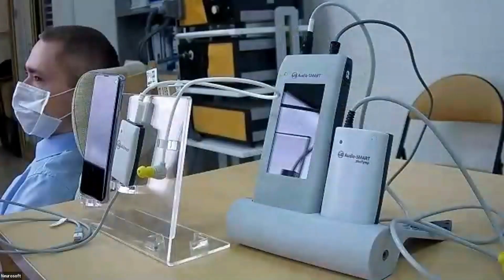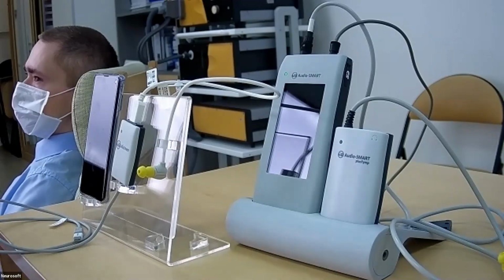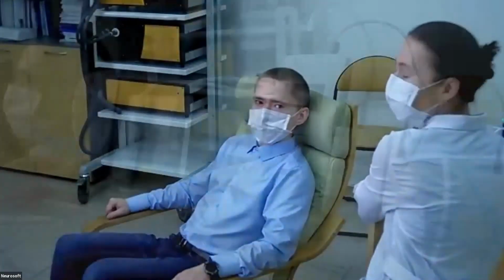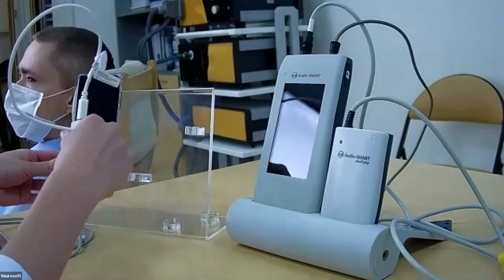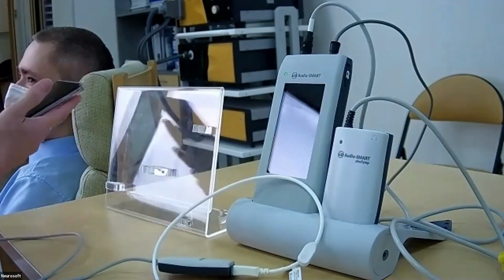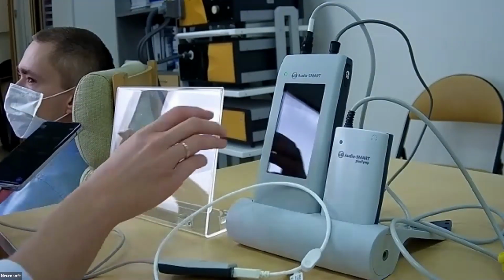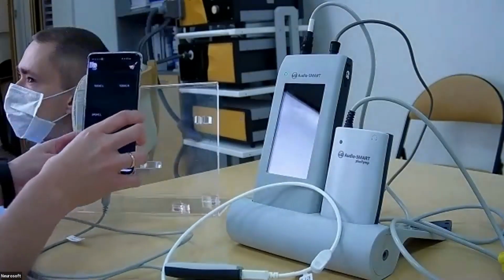Now we can go to the other patient. We use the aScreen, connecting to the smartphone. Yes, okay. I run the program.